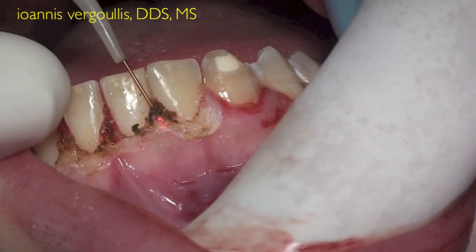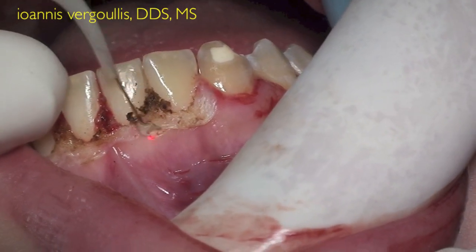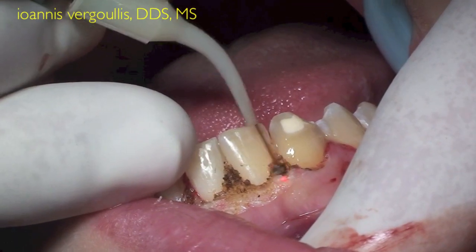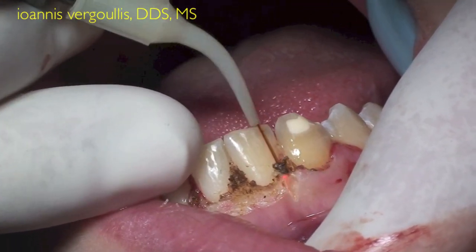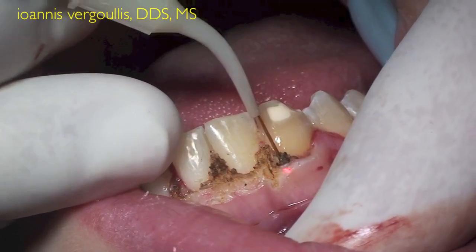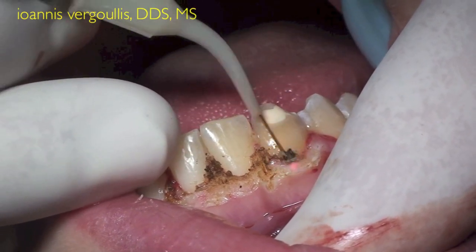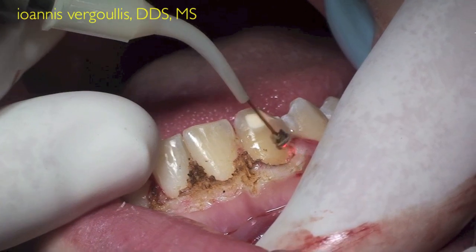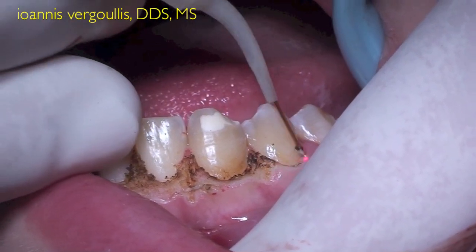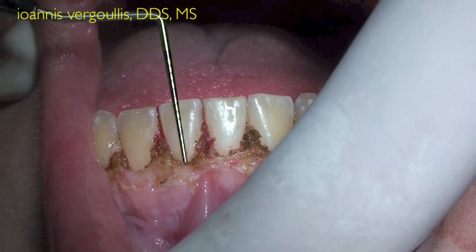While we are doing the procedure, we wet the teeth and the tissue, keeping them moistened, utilizing a wet gauze. So utilizing this technique, we were able to do gingivectomy and gingivoplasty from the first premolar to the first premolar of the lower anterior teeth.